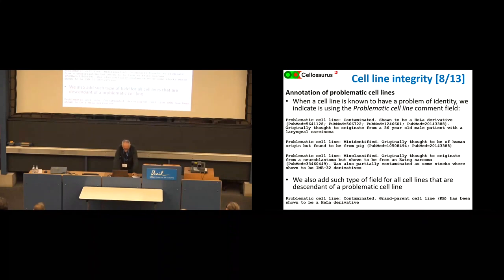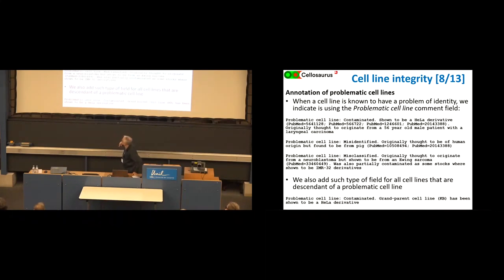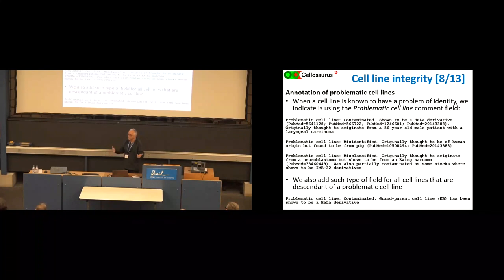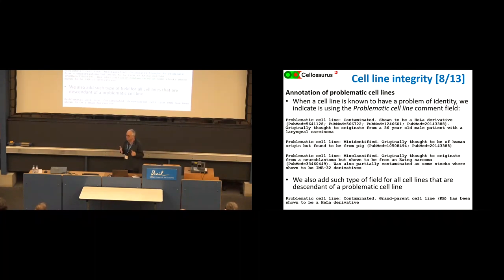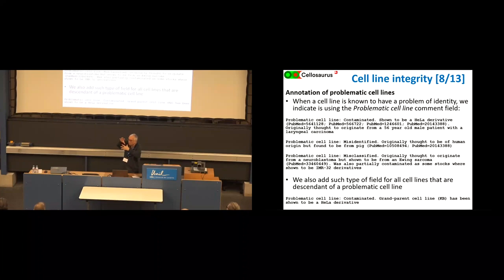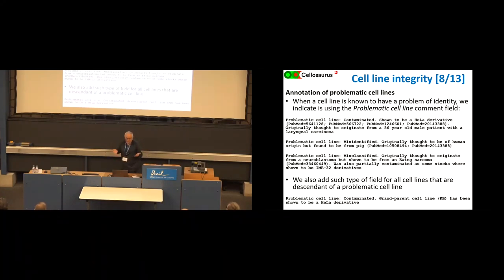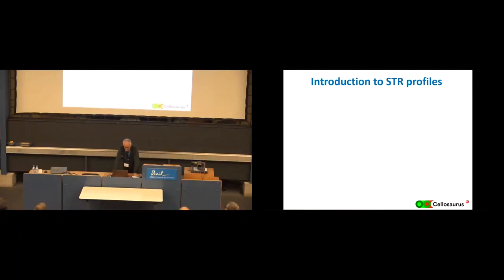We also flag cell lines that are descendants of a contaminated cell line, because sometimes that's a hidden problem. People know a cell line is contaminated, but some researchers created new cell lines from it before the contamination was known. So you have a whole family or hierarchy of cell lines that are wrong because they all descend from one that is not correct.